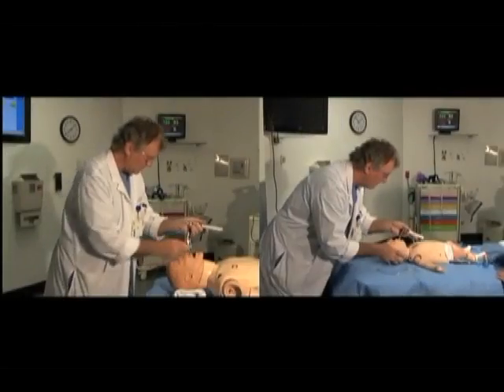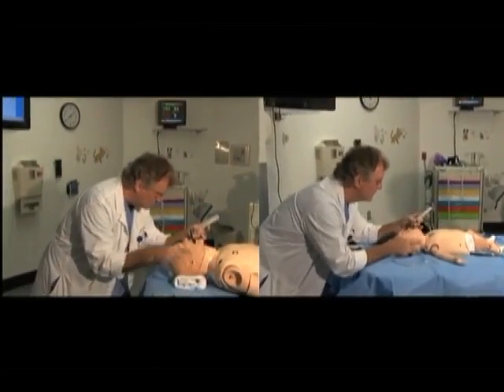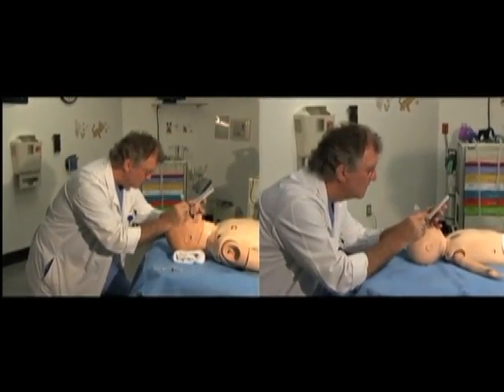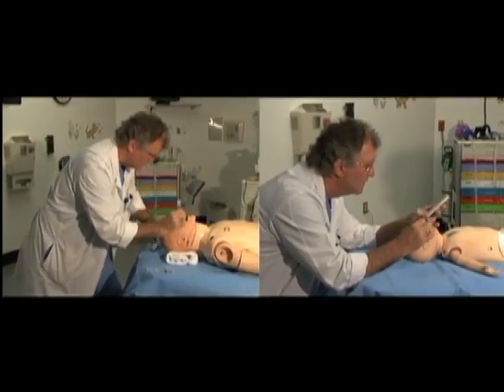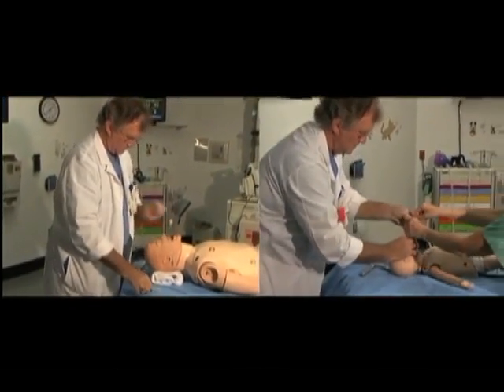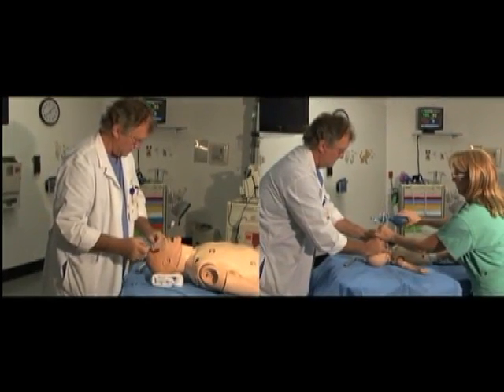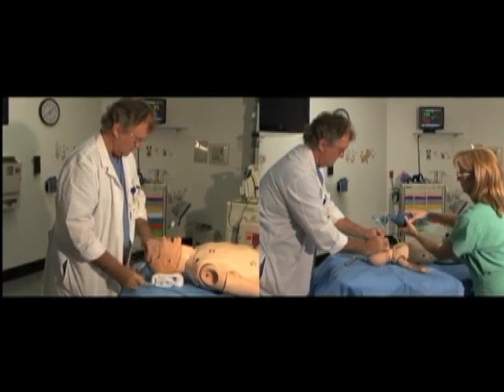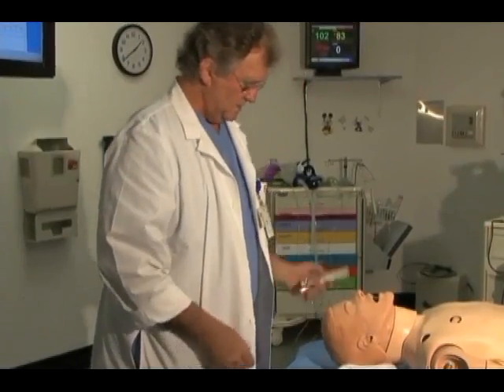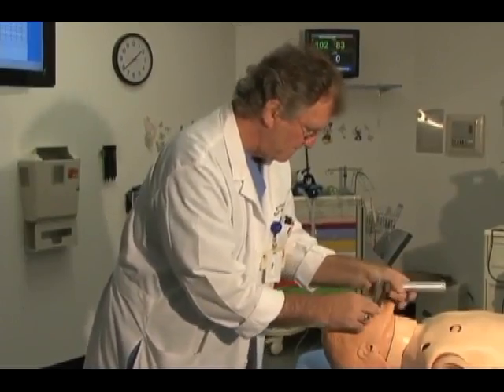Note in the side-by-side comparison how the angle of vision must be modified when intubating a child. The other thing to remember is that since the pediatric airway is higher in the neck, the laryngoscope blade does not need to be inserted its full length. Note in this sequence the ET tube is being inserted directly in the line of sight of the intubator.